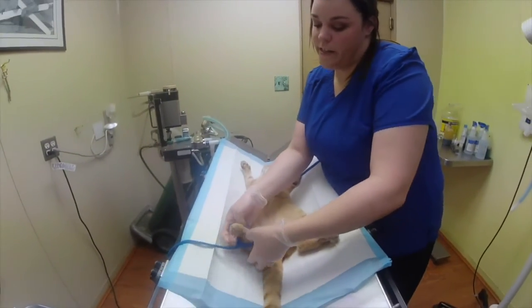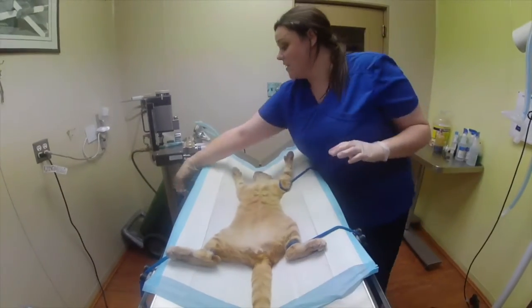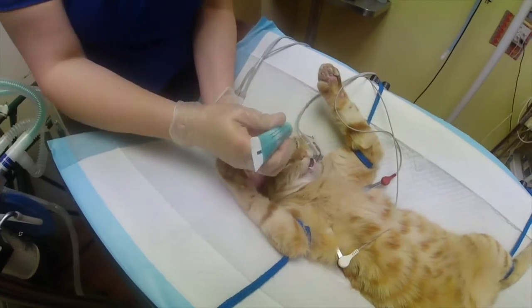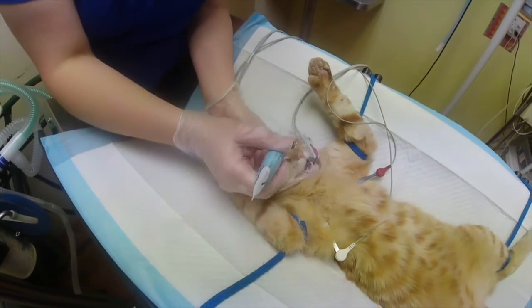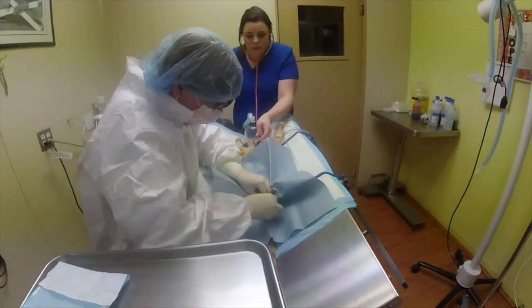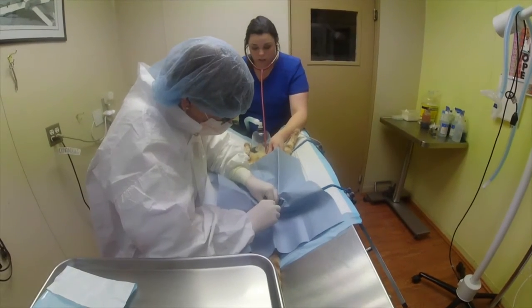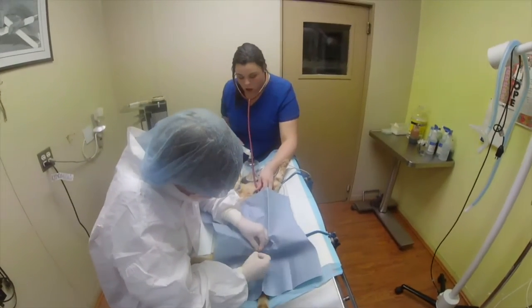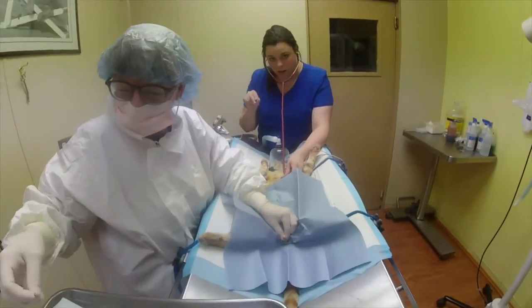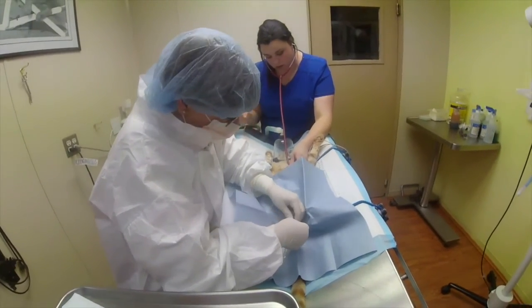Want to make sure your area stays aseptic so that it stays clean. Then you will apply eyelid lubricant, because if not, they will get corneal ulcers. Okay, so Dr. Lindley is doing a neuter on a cat, and I will assist by making sure the cat's vital signs are good. And we've got him hooked to oxygen and gas, the isoflurane, so that he goes to sleep a little more because he is slightly awake.